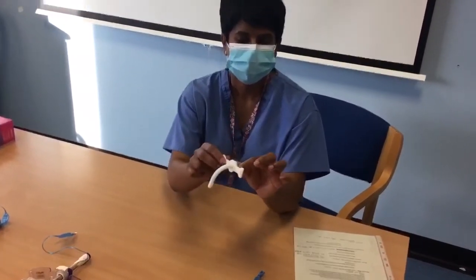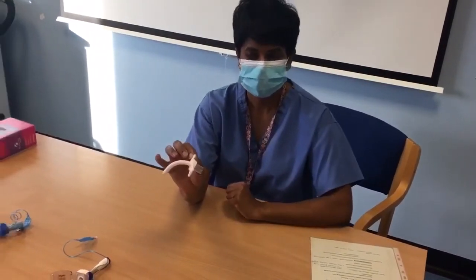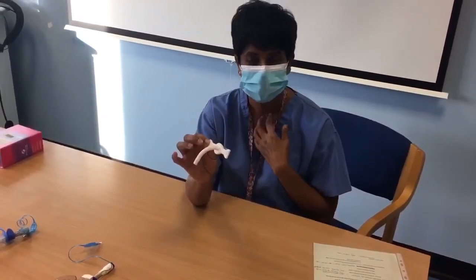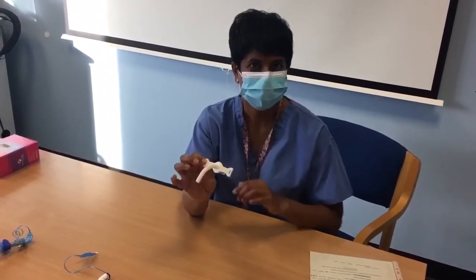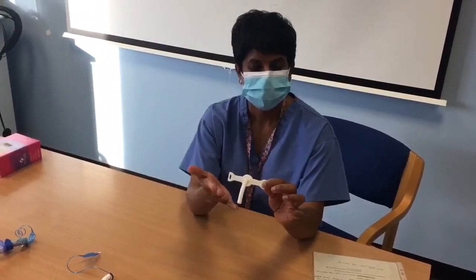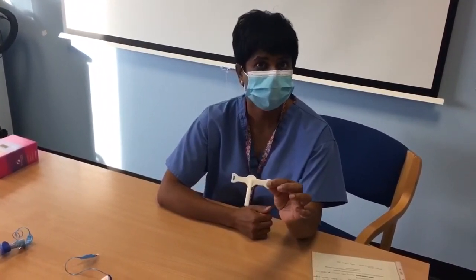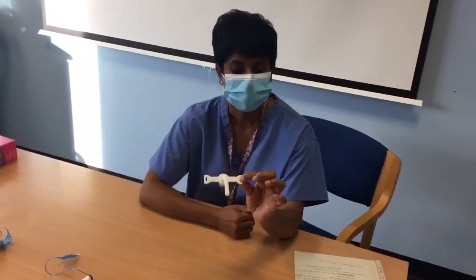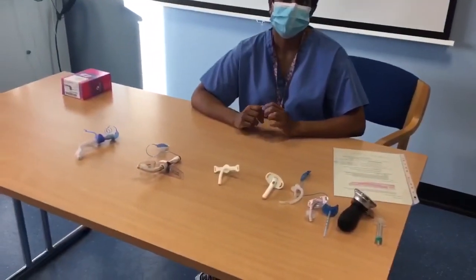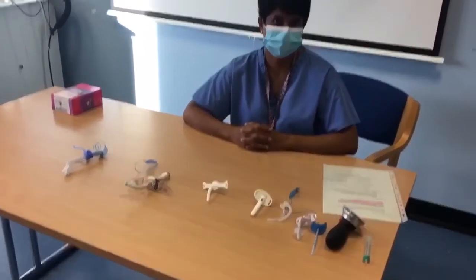Okay. So our patients will need to be very stable to be able to have the cuffless variety and able to clear secretions. Because if patients are discharged home with their tracheostomy tube, they've got to be able to clear secretions. Okay. These are gas permeable, so if we were using a cuffed tube, we would probably inflate the cuff with water as opposed to air, so it doesn't get absorbed. Okay. The decisions on which tracheostomy tube to be used is really up to the anaesthetist. They will always make that decision. We would never make that decision.